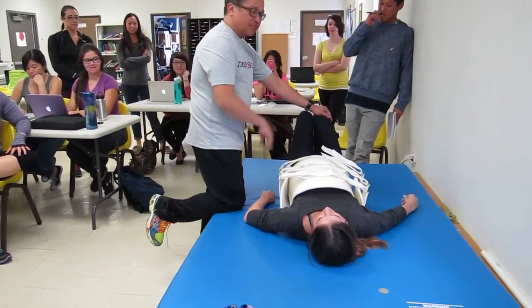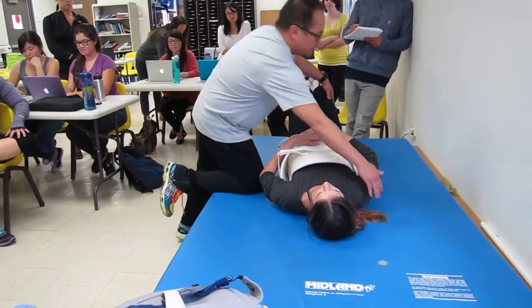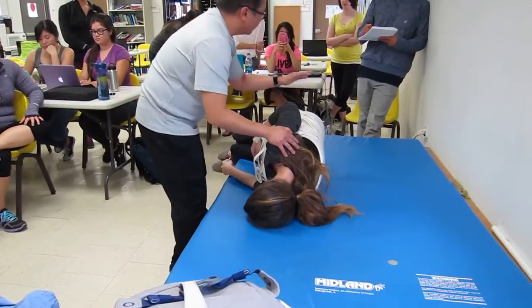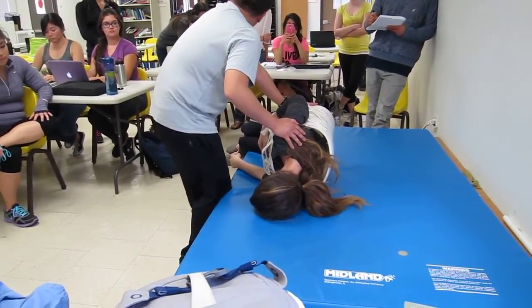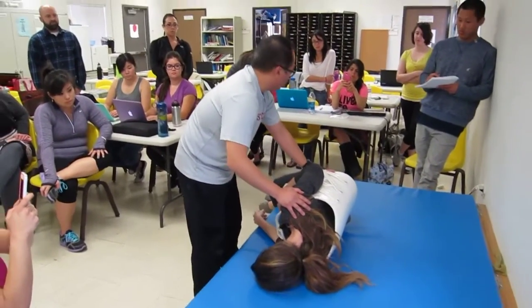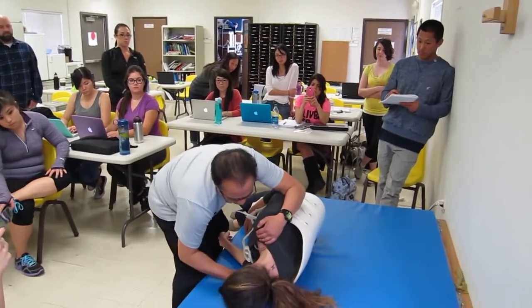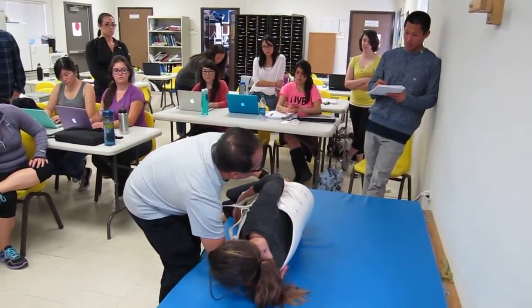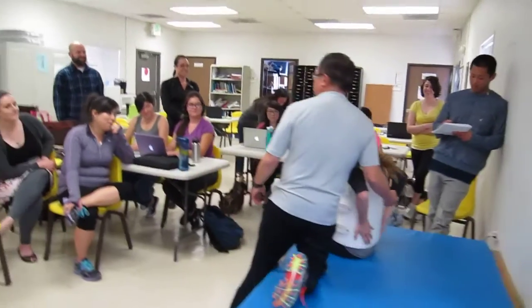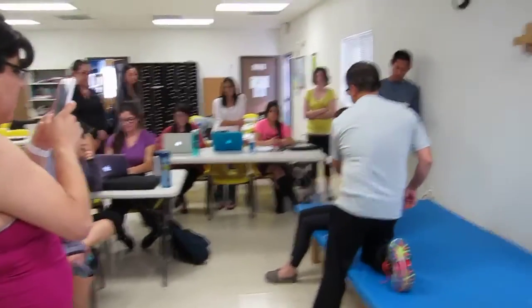Anyways, we're still going to do the log roll, getting her up out of bed. Same thing. And here, because this is going to probably block your ability to put your hand on the pelvis, you can just put your hand approximately where it should be if the person didn't have a TLSO. Okay. Questions?